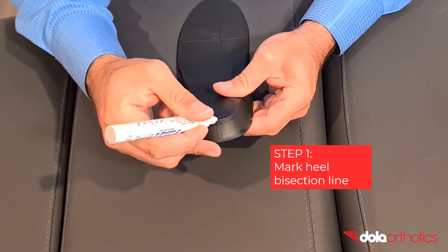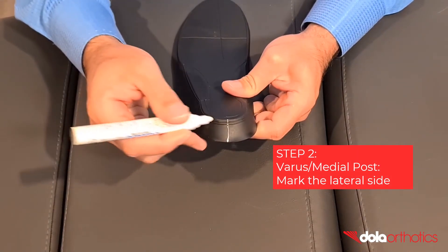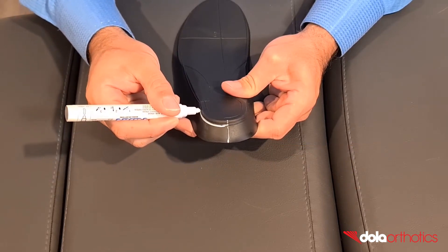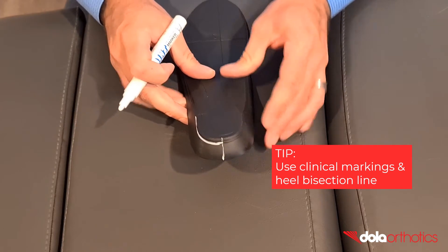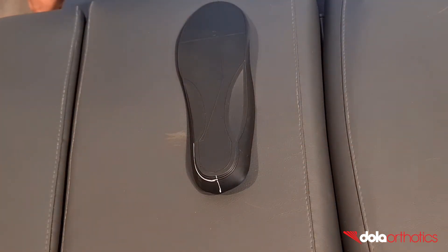Mark the heel bisection line. Step 2. For a varus or medial rear foot post, mark a point or line on the lateral side of the heel cup. Use the mild or moderate clinical markings, or use a tractograph to measure and mark your required angle. You now have your angle marked as a guideline for grinding.